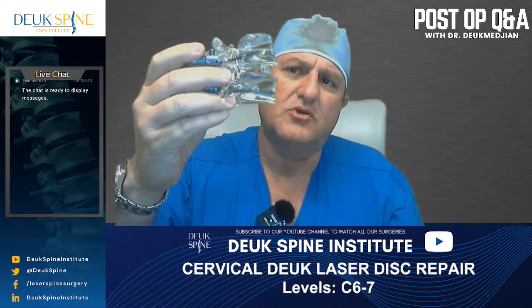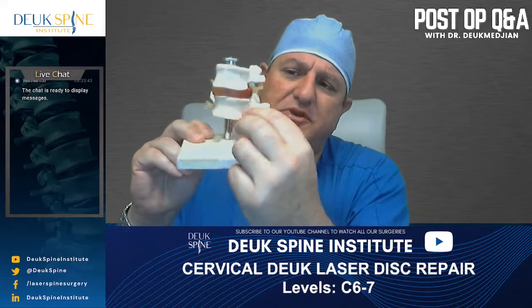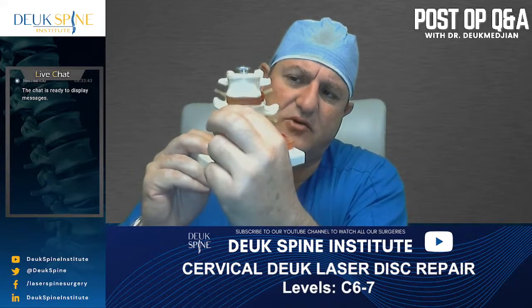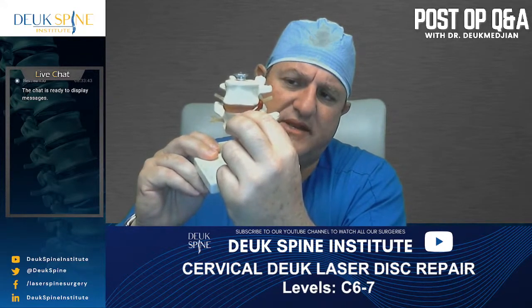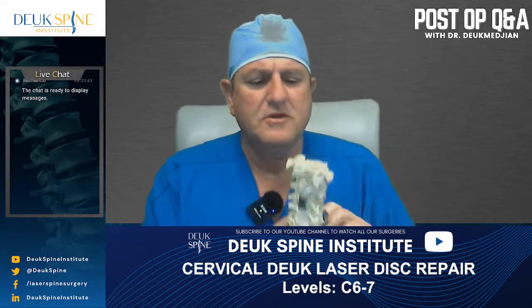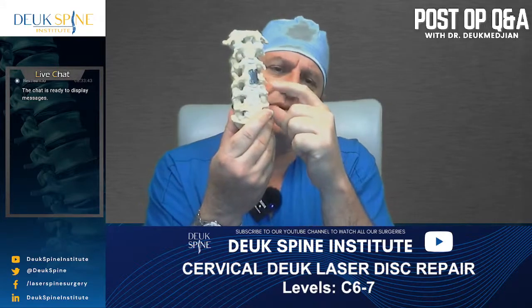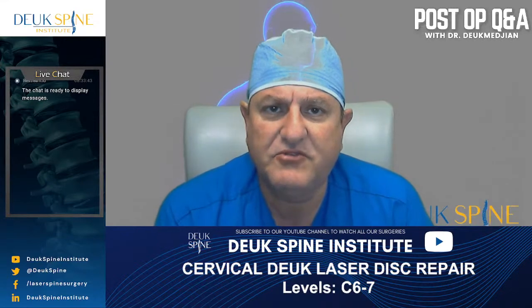I don't. The Koreans developed a technology where instead of taking the disc out, they actually pass through the disc to get to the herniation in the back, okay? And that's in the cervical spine. So you can see the herniations back here. Instead of taking the whole disc out, the South Koreans went through and basically used an endoscope to remove the herniation back here and then come out and leave the front of the disc alone. So there's no need to perform a fusion with a metal plate and screws, and there's no need to put a cage in there. There's also no need to put an artificial disc. So this is advanced technology. This is state-of-the-art type surgery that's only found in a few places in the world.